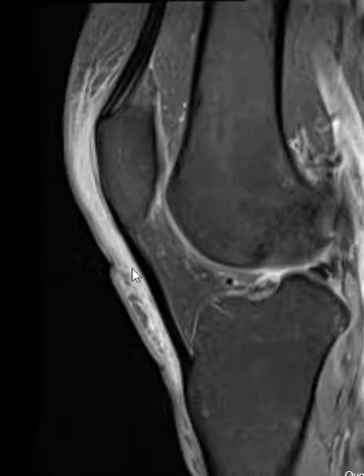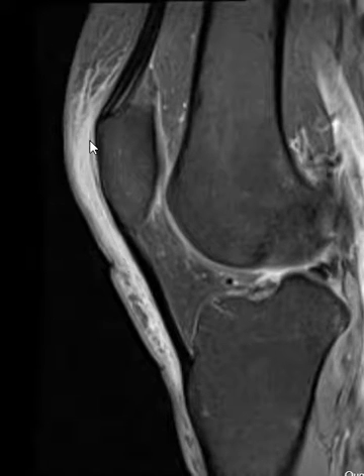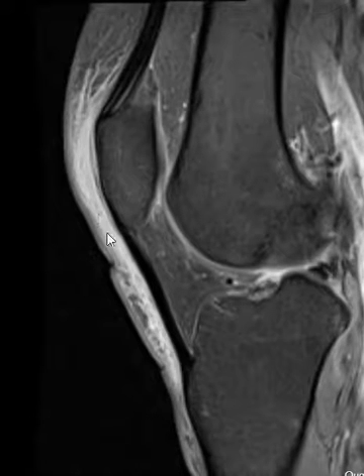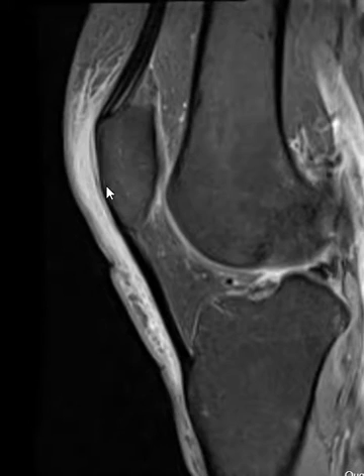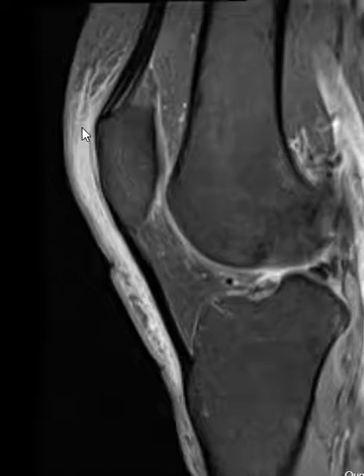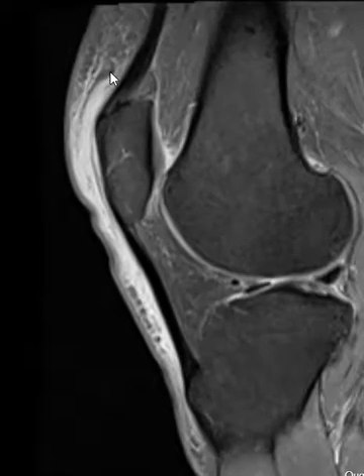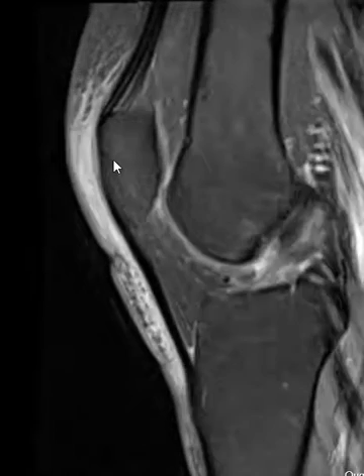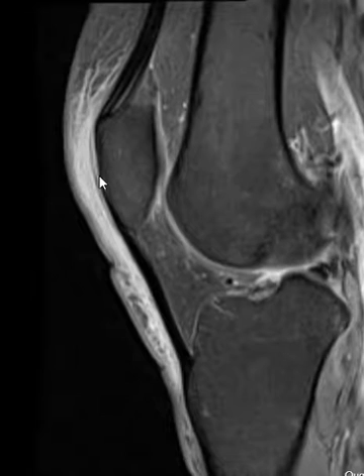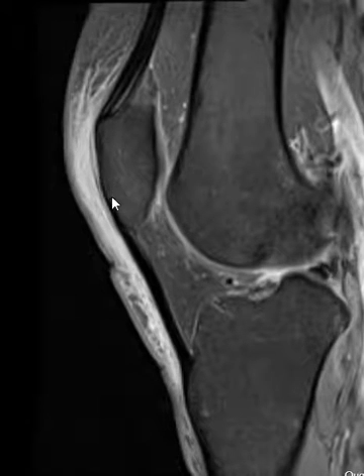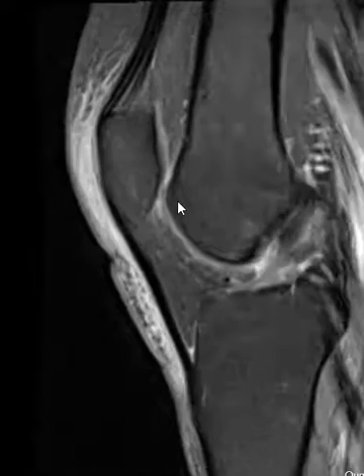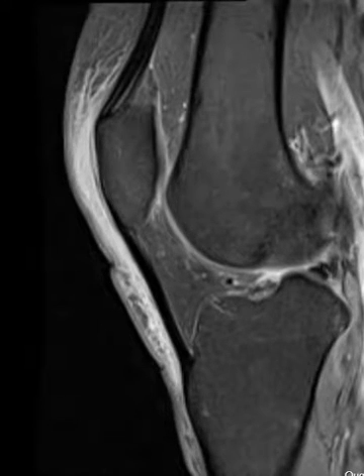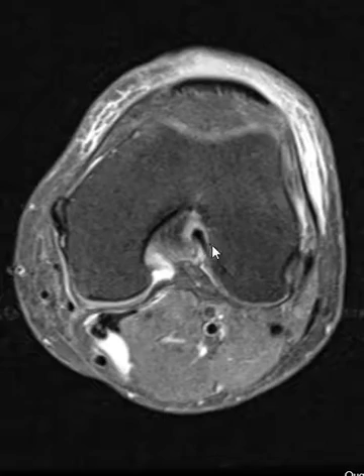There's a bursa out here — they can get inflamed, it can fill with fluid. Sometimes you see a big fluid collection, other times it's less well defined like this, but there's fluid in the pre-patellar bursa and also in the surrounding fatty soft tissues all around here. The knee becomes hot and swollen. Sometimes it can be infectious, other times not. Again, it's a case of pre-patellar bursitis; otherwise the knee was very good.